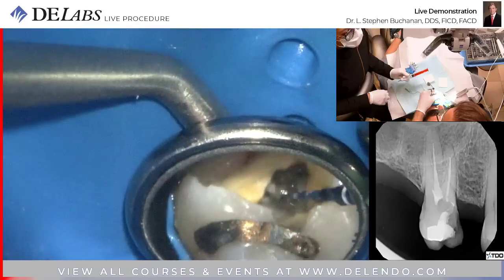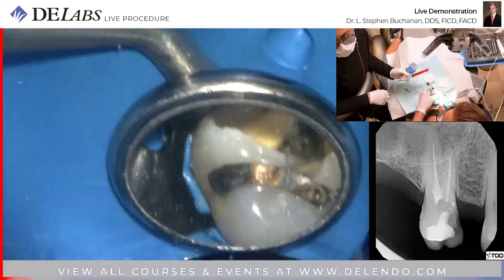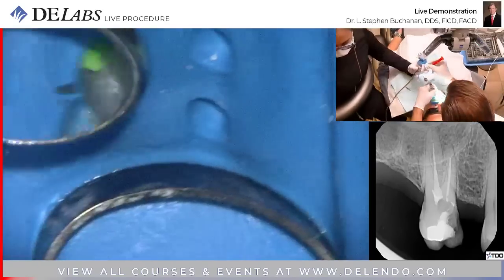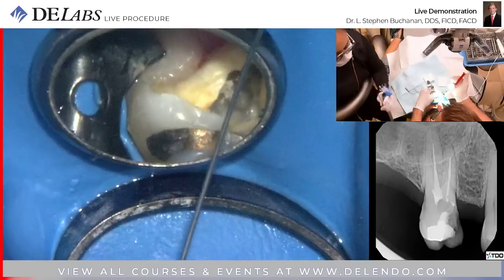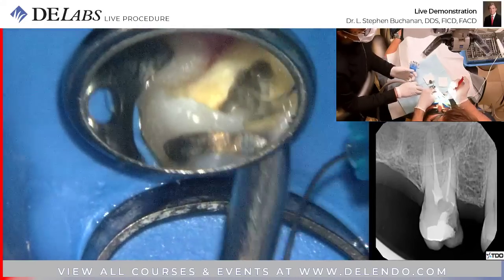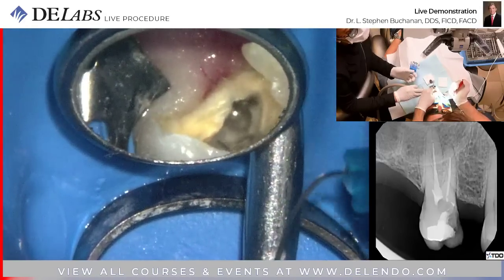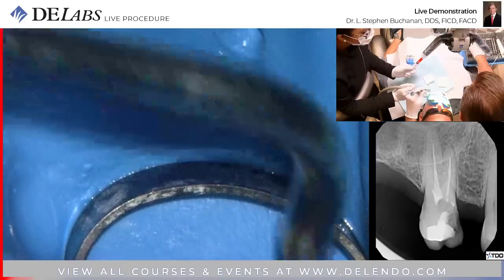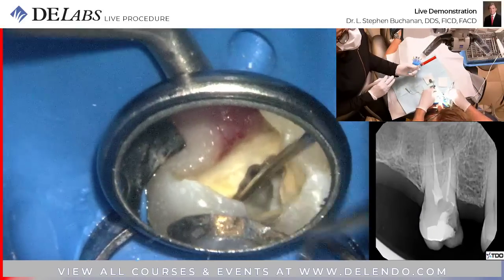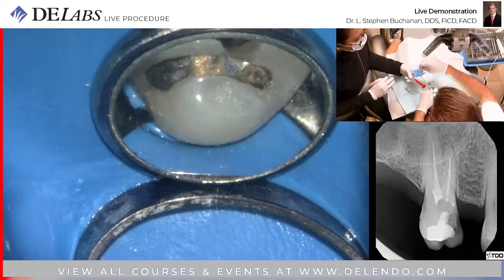It's going in. Interesting. I think I met an impediment, but let's find out. Quit moving. Definitely. Let's take a little 08 file.